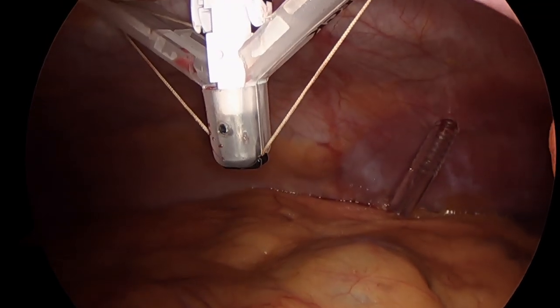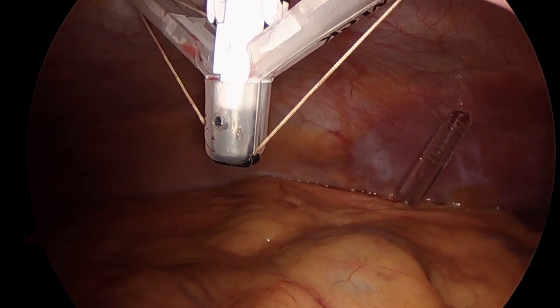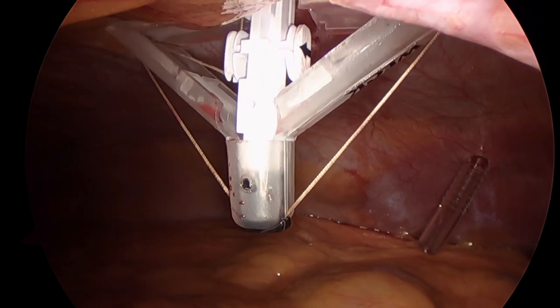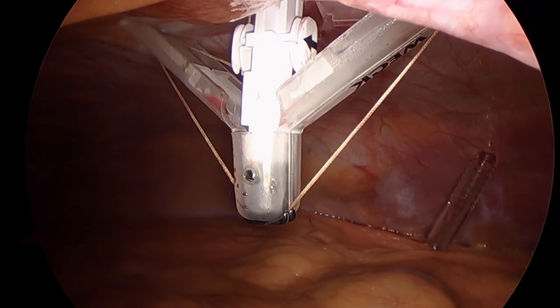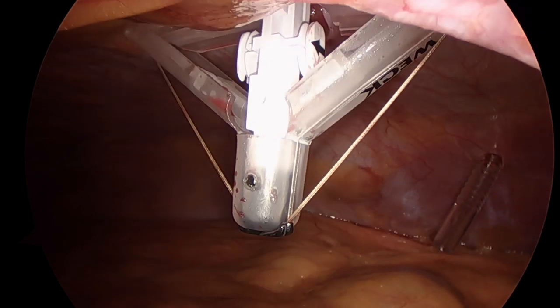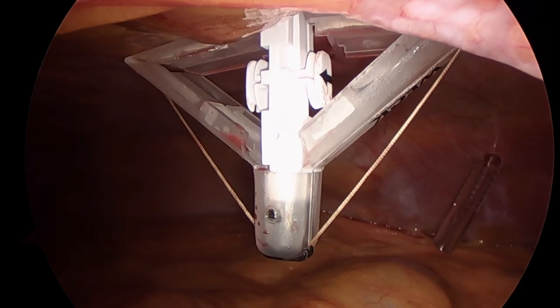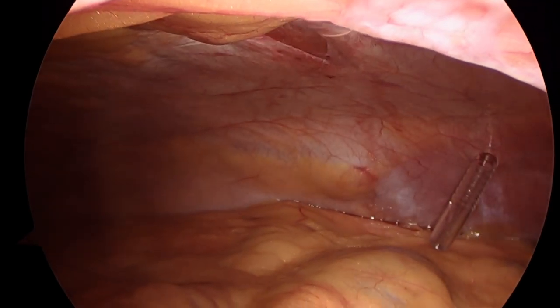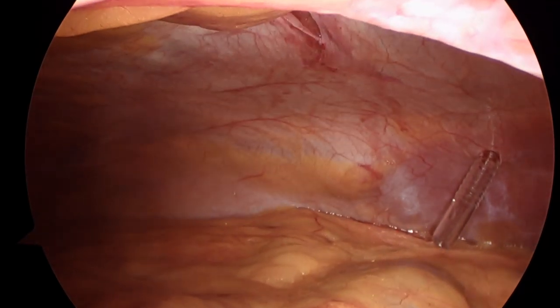We routinely close our specimen retraction site due to the stretching of the fascia, using a commercially available fascial closure device. After the conclusion of this procedure, the patient was admitted for a single night hospital stay, placed on a stage 2 bariatric diet, and discharged the following day.